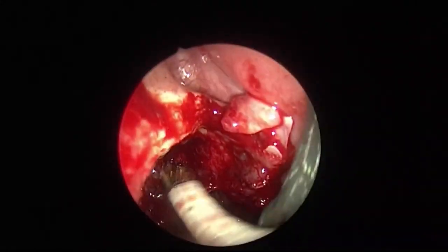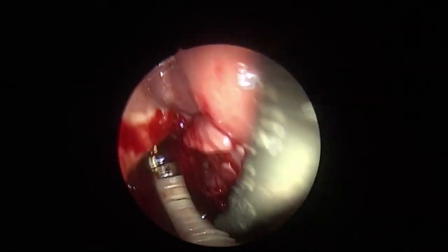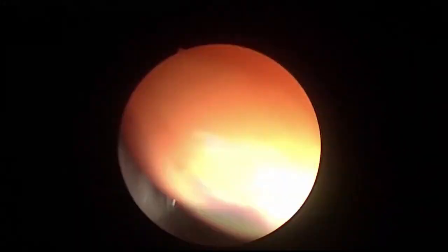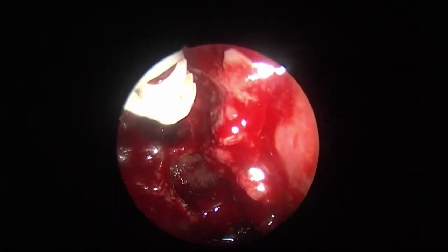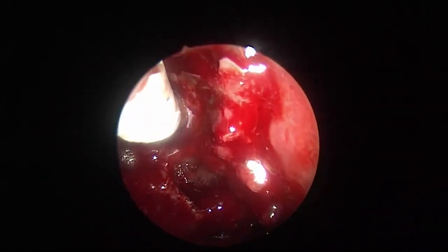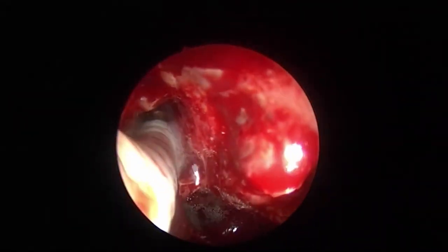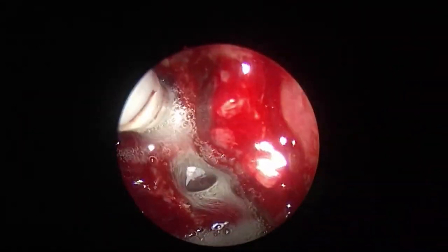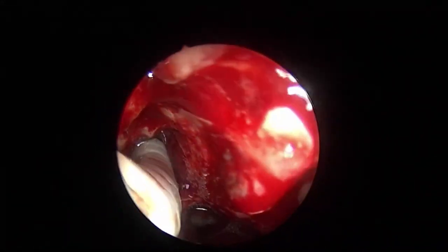See, I am going in the frontal. This is 360-degree rotatable. I pushed into this, and now this is a jet. High pressure jet, 360-degree. You can rotate.